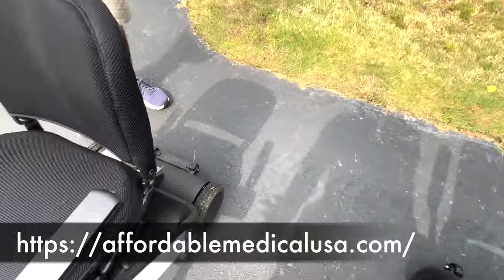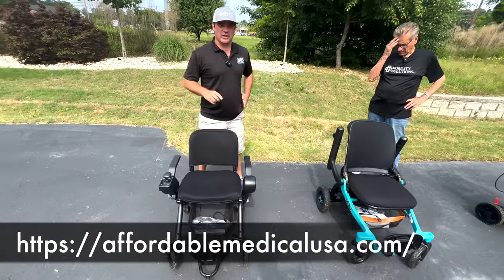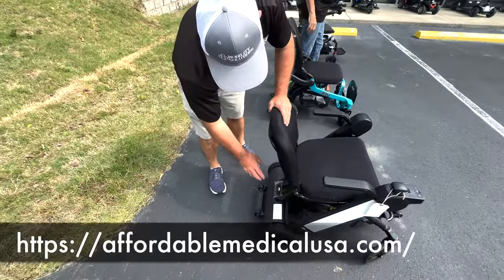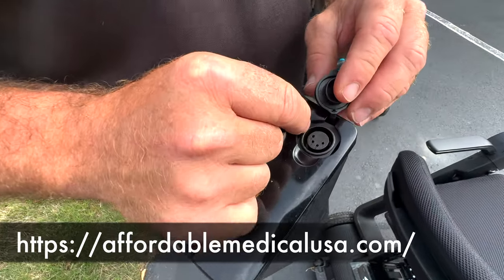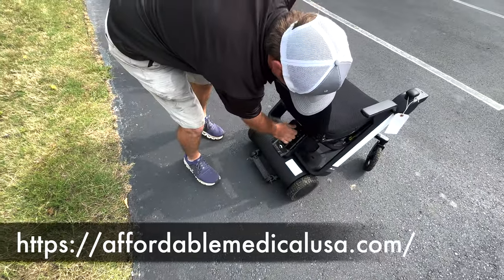How you can charge this unit is different than all three of these. You have one way of charging it unless you buy the accessory port that you can bring up here. I don't know really how that would work on this particular unit. But this is the battery. You can charge it right through here. You can keep this in to charge it.